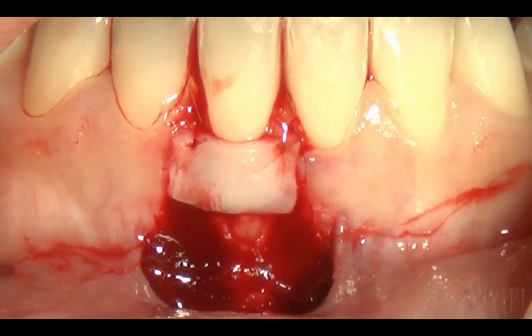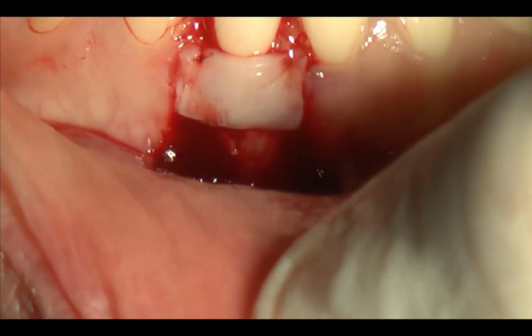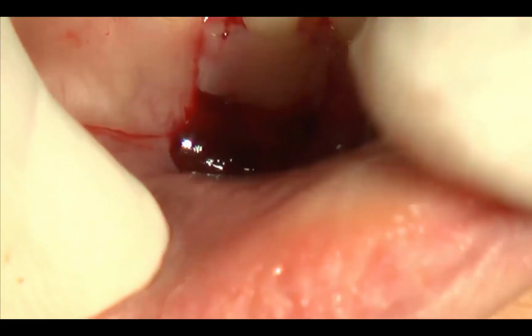You see that the graft does not reach the most apical extension of the root exposure, and this is not necessary.